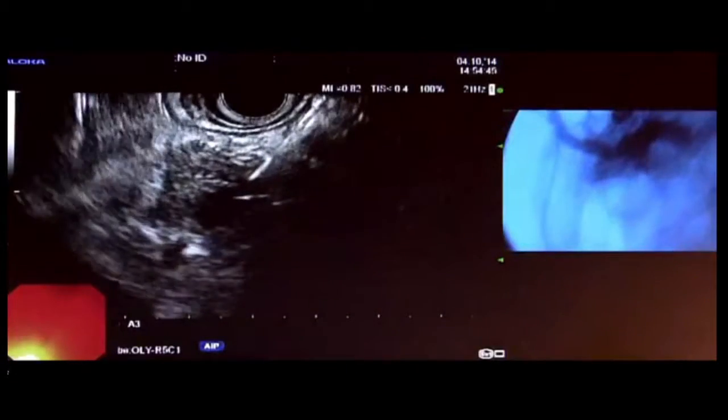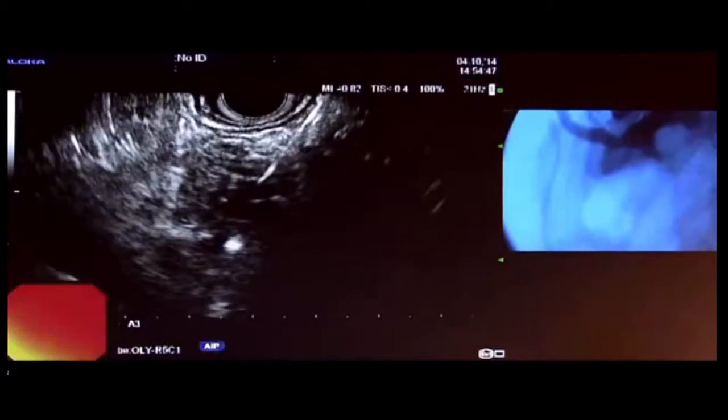Can you guys center the fluoro for us? We need an extra pair of hands here to help us. Oh. I don't think I'm through yet, although I might be. I'm going to move the fluoro. Part of me thinks we're through, actually, we popped through. But I'm going to feel better if I see this wire moving further down more freely.